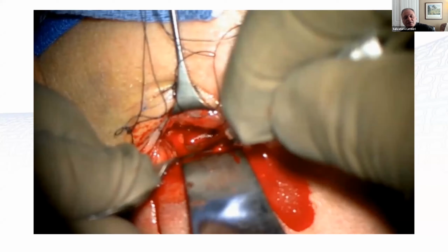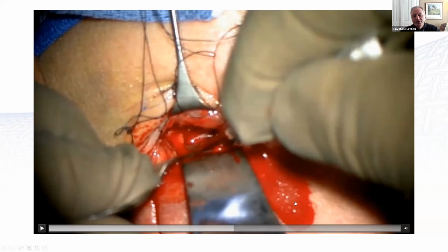For the hemostasis, I have found irrigating and sucking, with cold saline, will actually stop most of the bleeding. If I do see a little bleeder, I'll touch it with that tungsten tip cautery or with the bipolar, but most of the time just packing it will be fine. As far as a commercial brand like Flow Seal, I generally don't use that, but if it's a real bad injury, I will use it. But you have to suck all that stuff out because that will expand. So you never want to leave that in. But most of the time, packing will take care of it.